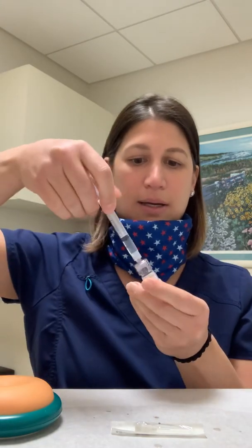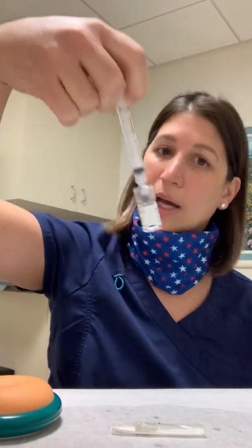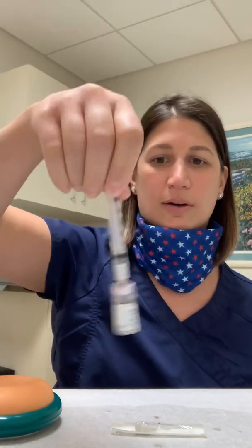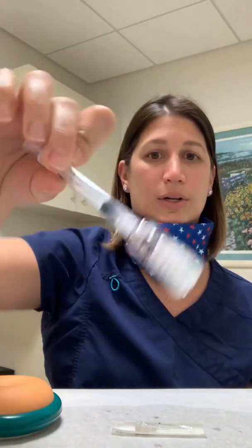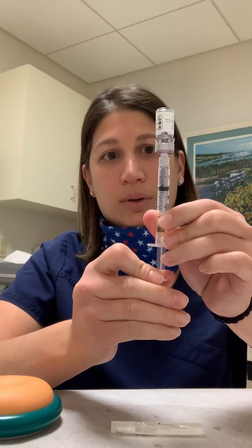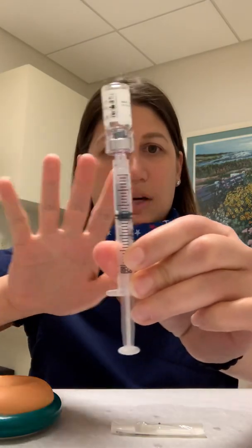You're going to take that cap off and push the Q-cap onto the Menopur vial. You're going to inject all of the fluid in and swirl it gently — do not shake it. Give it nice little swirls as if you're swirling coffee. Let it mix; it mixes fairly quickly and will be clear just like water. You're going to turn this upside down, push any air in the syringe into the vial, then pull everything out. You'll have a chunk of air at the top — that's perfectly fine.